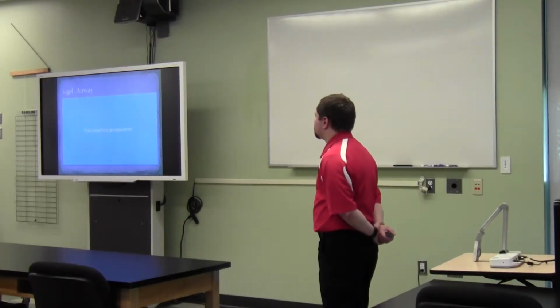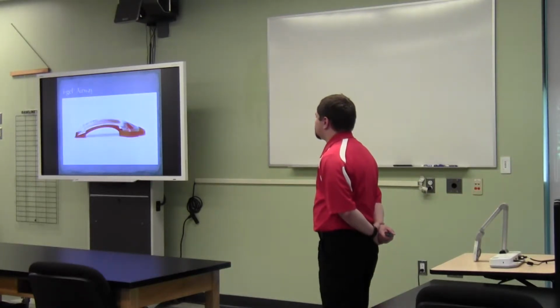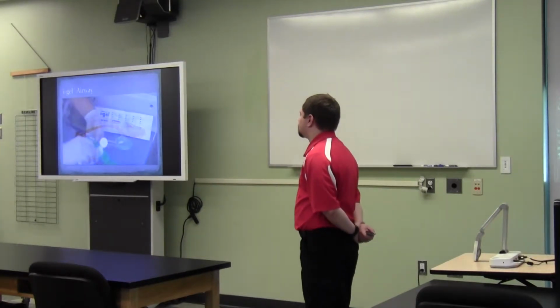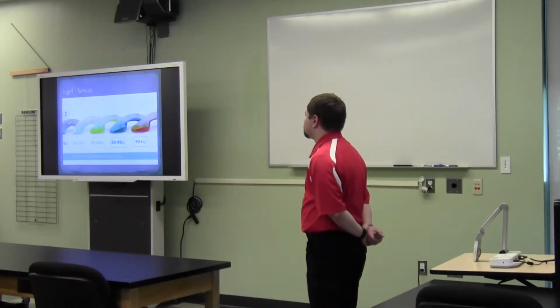Pre-insertion preparation. iGel is supplied in a sterile pouch enclosed in either a protective cradle or a cage pack. This innovative packaging is color-coded for size and designed to ensure the device is maintained in the correct flexion prior to use. It also acts as a base for lubrication. Select the appropriate size iGel according to patient weight.